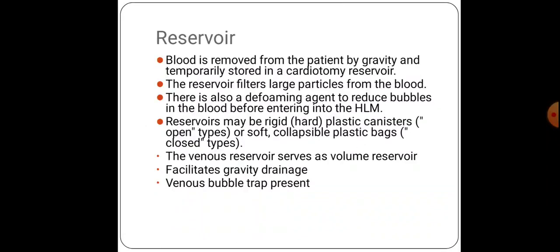Next one is the reservoir, so already we know that. The reservoir is a storage container. It stores the blood. We already know that with the help of gravity we are taking the blood from the heart and it is stored in the reservoir.